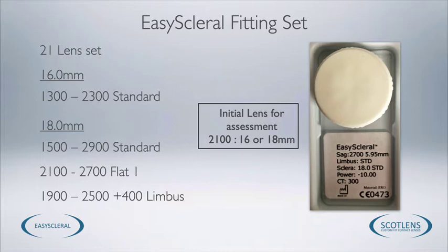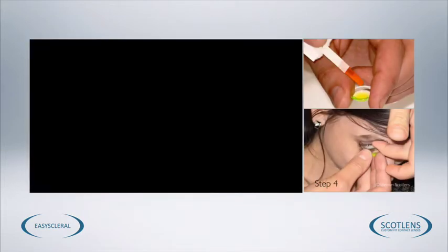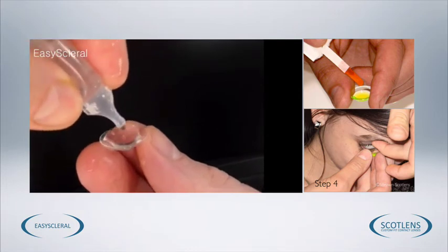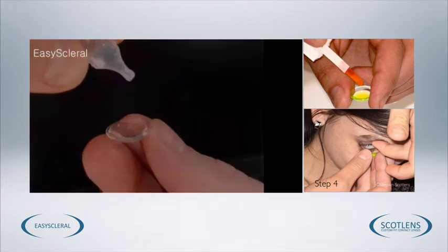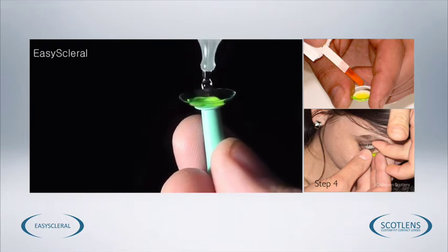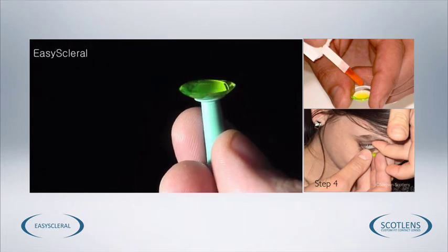So once we've selected a lens, we need to insert it. This is simply done by filling the lens with preservative-free saline. The lens can either be held on the fingertip or it can be placed onto a contact lens sucker. We then want to instill a small amount of fluorescein into the saline that fills the lens, and then we're going to place the lens on the eye.